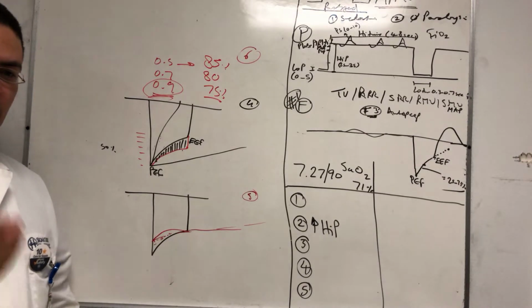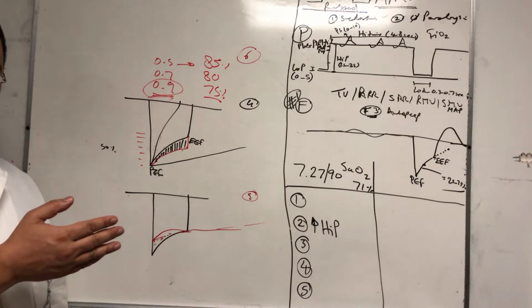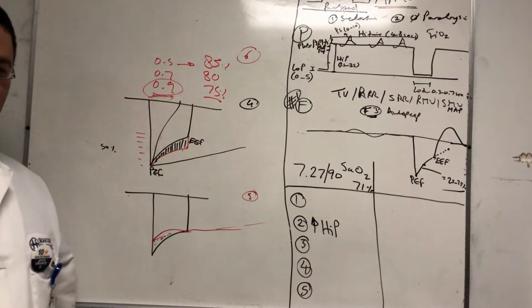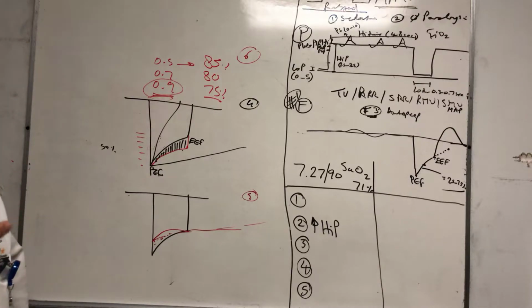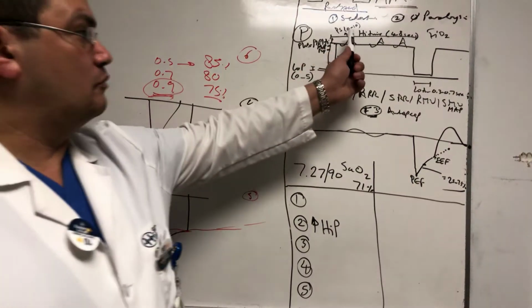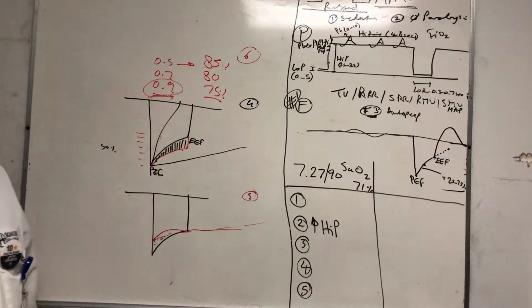So conceptually, you can conceive this mode as if, in all the other modes of ventilation, you ventilate like this: PEEP and ventilate above, PEEP, ventilate above. This one, consider it as if you're at PEEP, ventilating below. So that's why you end up getting such high PEEPs. So when I say high pressure of 35, that is the PEEP. The PEEP is around 35. You can consider that the PEEP.